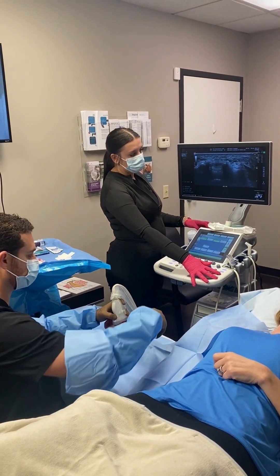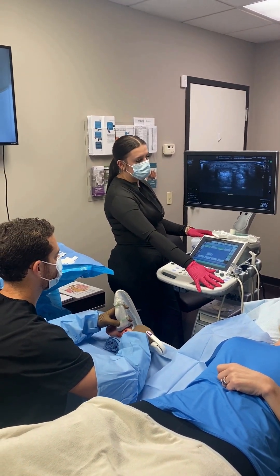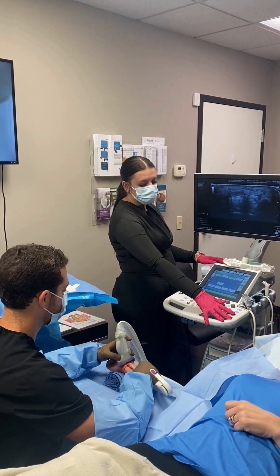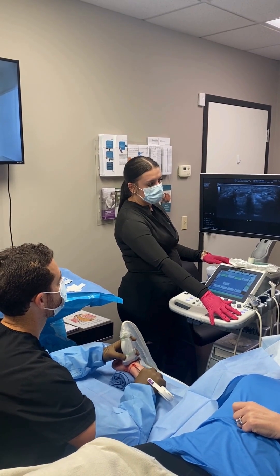Then we put our Sonex device into the area and position it using the ultrasound guidance. Once we're in the proper position we can inflate balloons and cut the transverse carpal ligament.